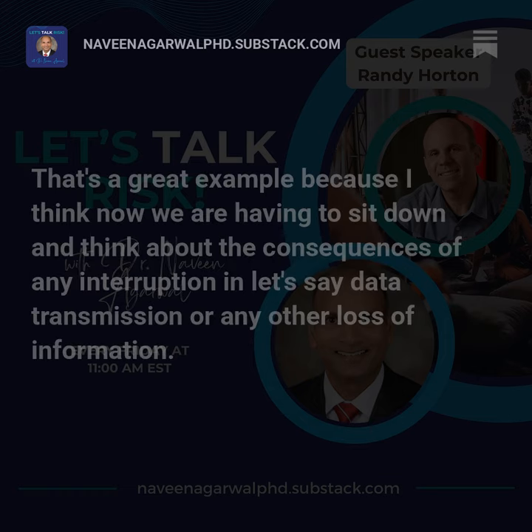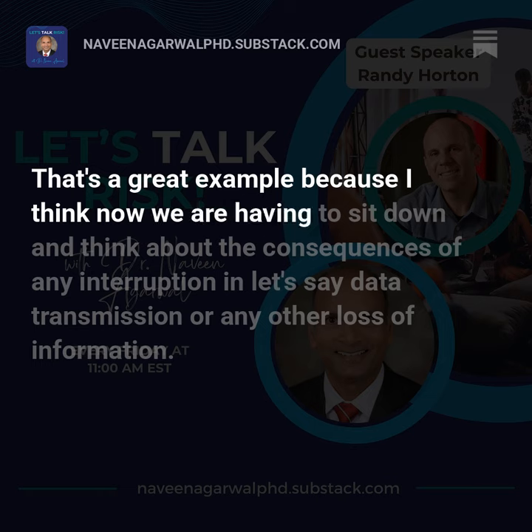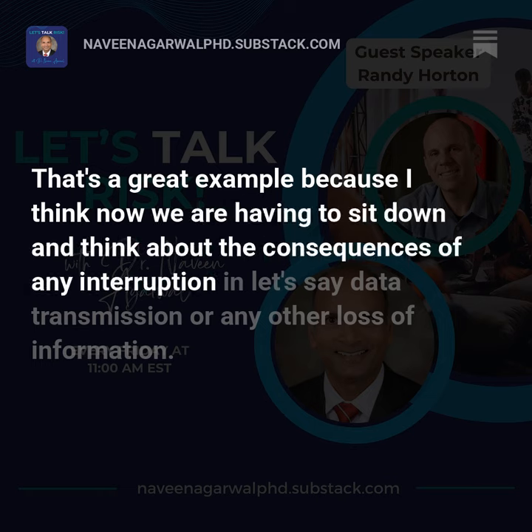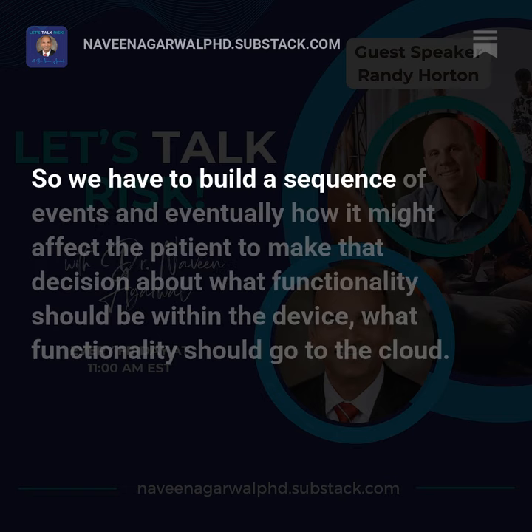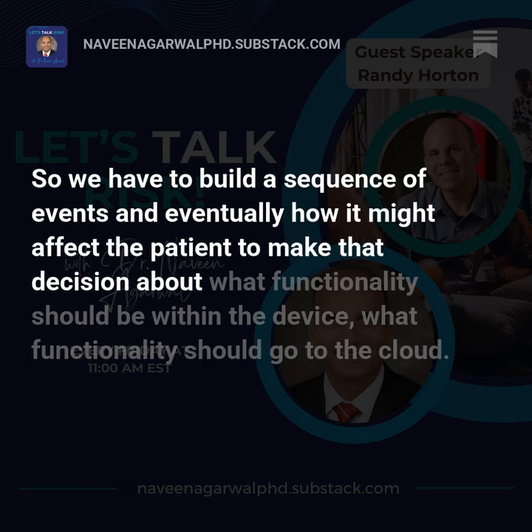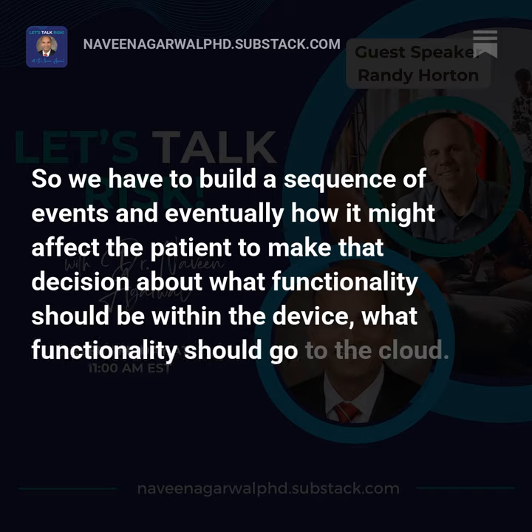Yeah. That's a great example, because now we are having to sit down and think about the consequences of any interruption in, let's say, data transmission or any other loss of information. What happens next? So we have to build that sequence of events and eventually how it might affect the patient to make that decision about what functionality should be within the device, and what functionality should go to the cloud.